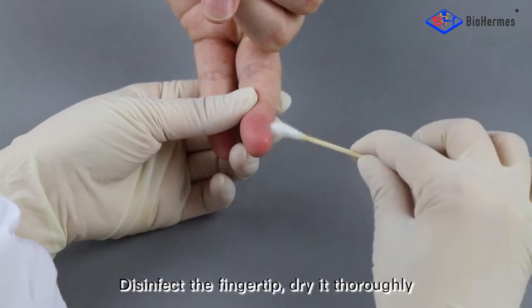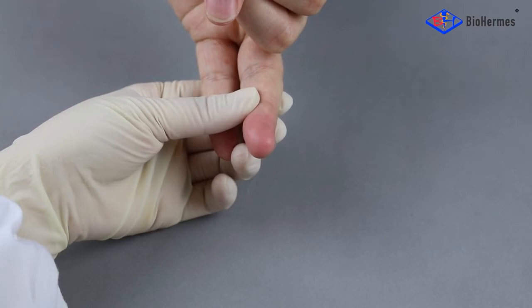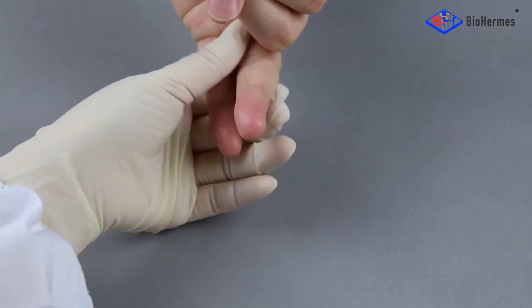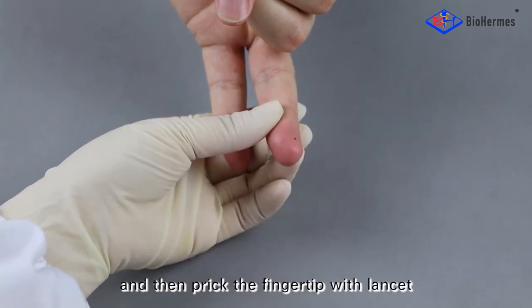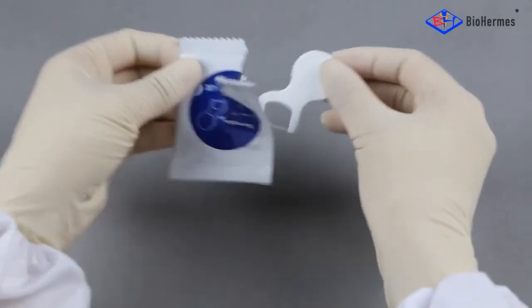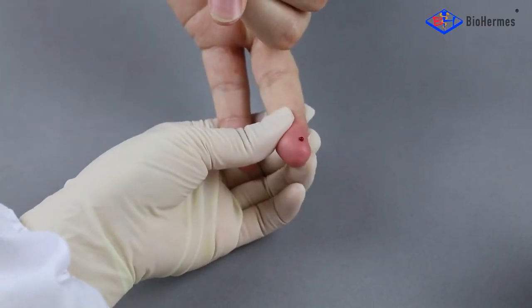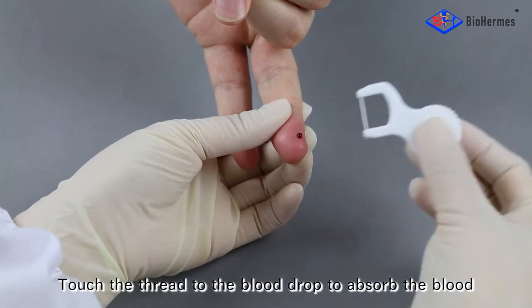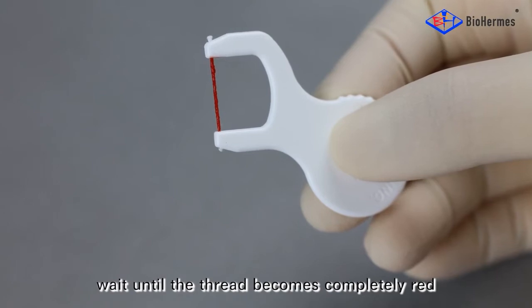Blood sampling: disinfect the fingertip and dry it thoroughly. Prick the fingertip with a lancet. Take out a sampler and touch the thread to the blood drop to absorb the blood. Wait until the thread becomes completely red.